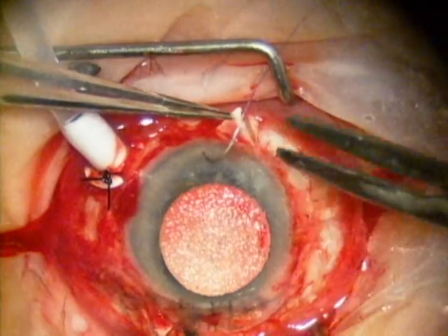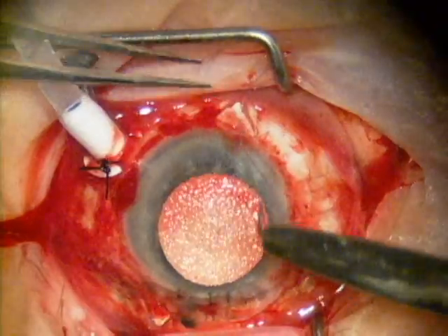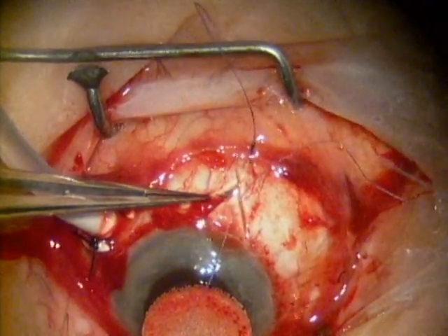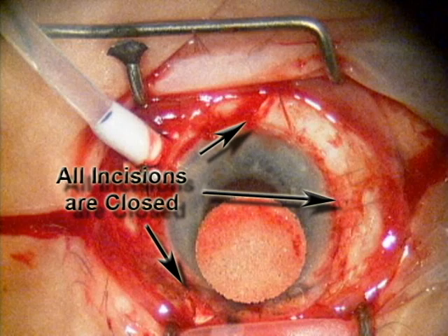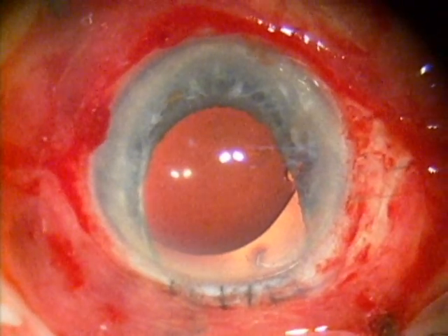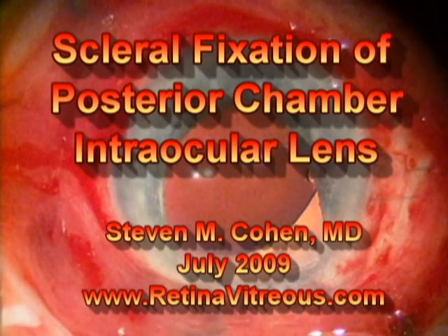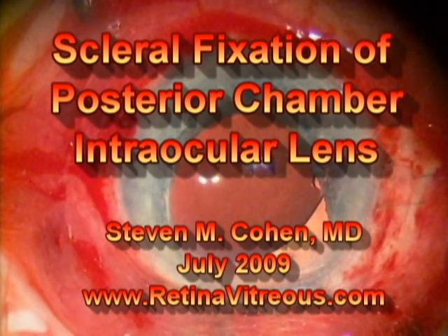You may notice on the top left of the screen is an infusion cannula. That keeps the eye pressurized and I place that just in case something happens and the lens dislocates and further surgery is needed at the time of the lens placement. Thank you for your attention. I hope this video was informative. There you see the lens nicely centered and this patient had an excellent visual result.